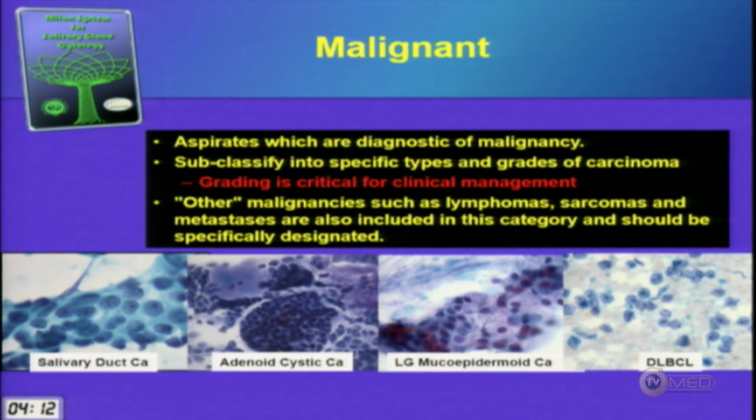So here's an example of an overtly malignant FNA. If you have ancillary material, you can do the androgen receptor and show that this is salivary duct carcinoma. This is a classic example of adenoid cystic carcinoma. Maybe the clinician tells you, or you did the FNA, you know the patient has nerve symptoms already. Any nerve symptoms, it's carcinoma until proven otherwise.